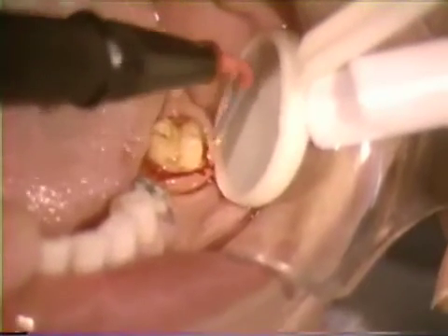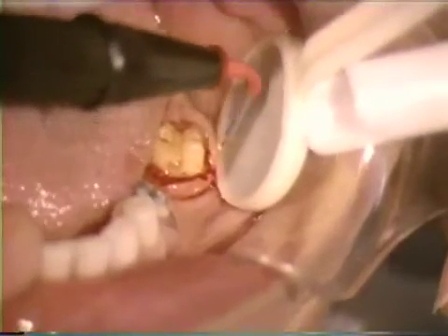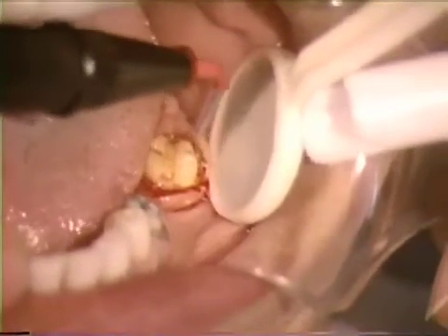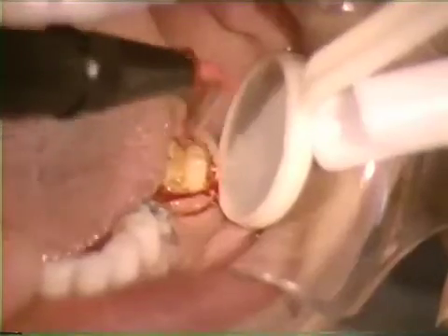A shielded electrode is useful for producing narrow circular troughs. This type of electrode tip can be rested against the tooth, thereby maintaining better instrument control.